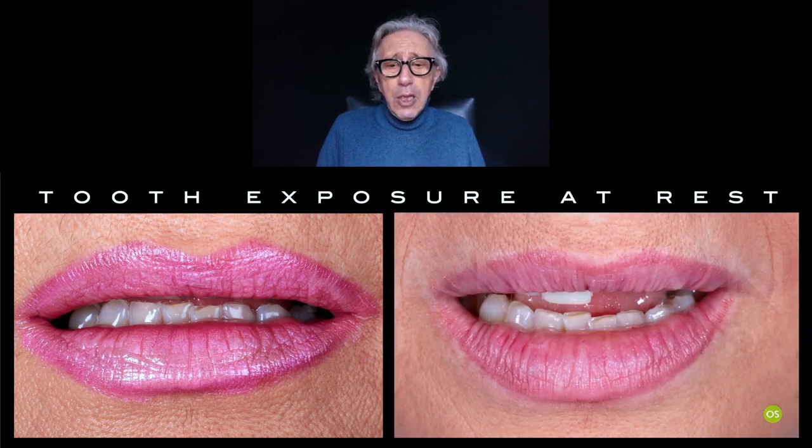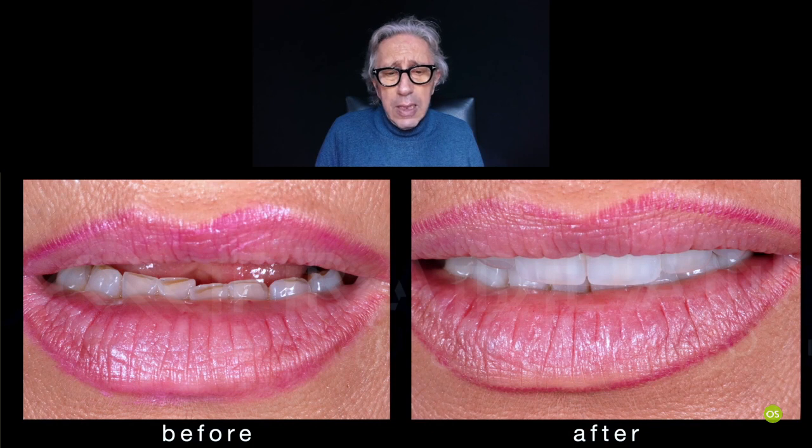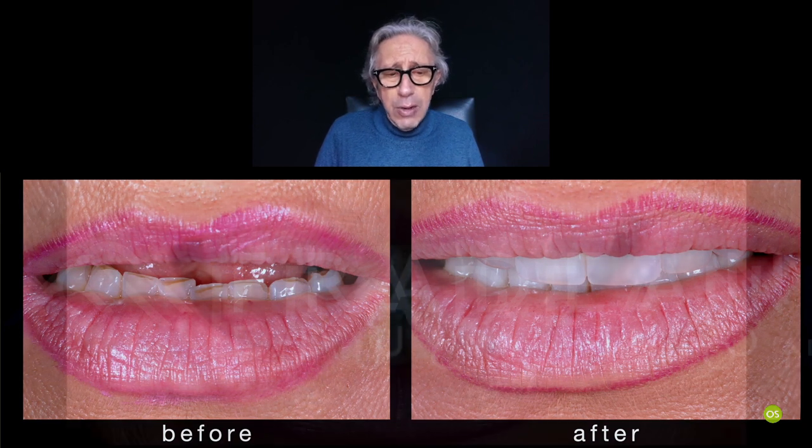So what to say? At this point, you can use the mock-up when you have to add length. We have done this kind of solution, for example, on the central incisor of the upper jaw on the right side, and you see that we can show something at this point, different from the left side of the upper. So if you also add the left side, we have some visibility, maybe 1.5. She's a lady in her 50s, and that is what we need at the end. And at the end, we achieve this result, covering the lower teeth, which are also brownish, with the upper teeth.